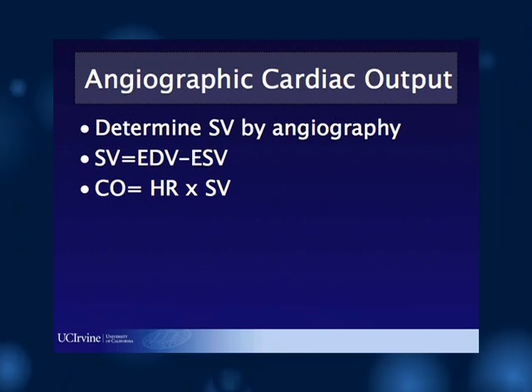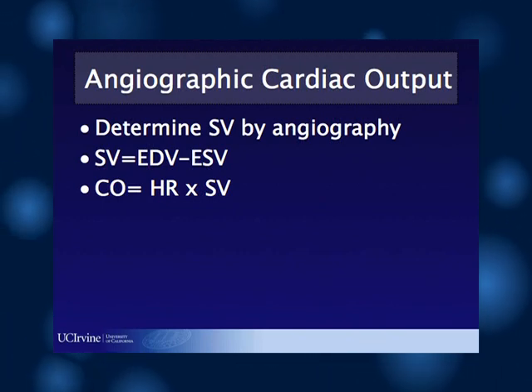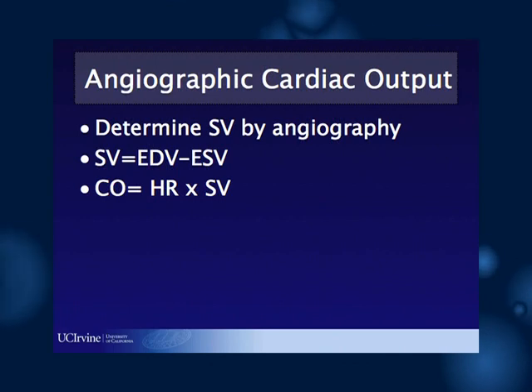This method has not been used in the last few years, but has been a standard in the early days of cardiac catheterization.